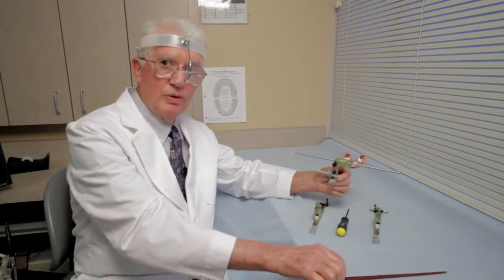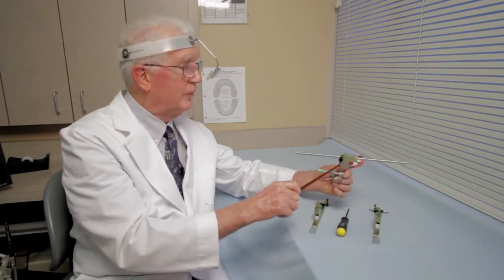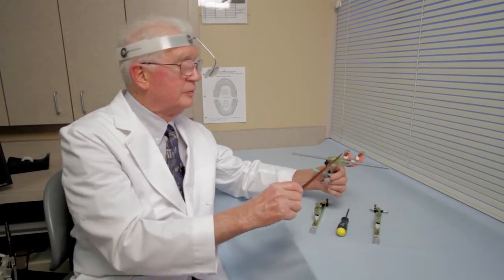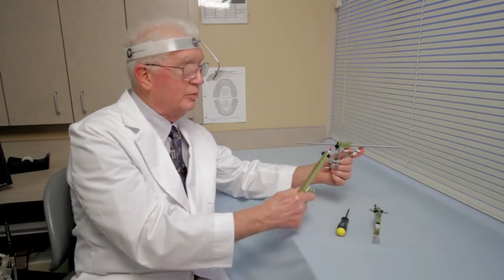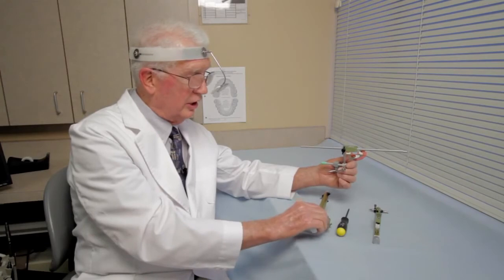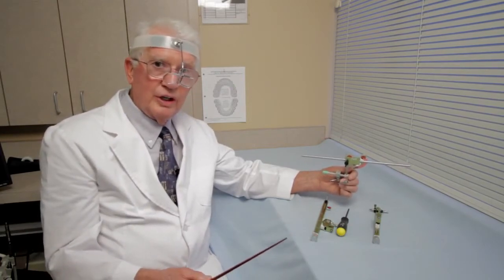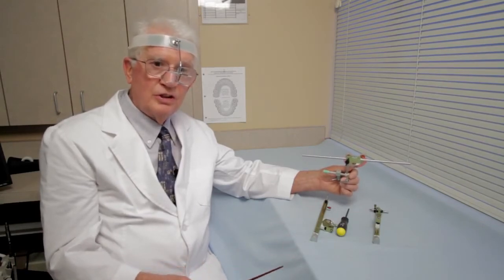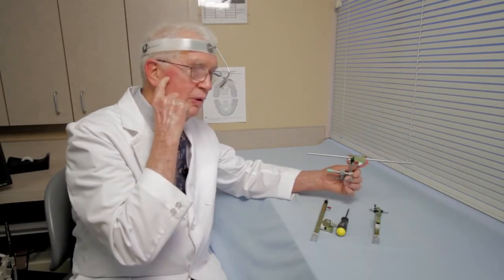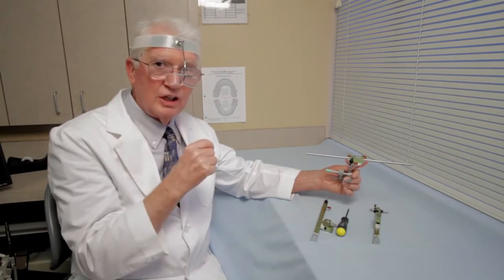And then after we did the ear bow, we took off the bite fork assembly, and I placed this crossbar on. This crossbar then is used to hold the side arms when we start to take the hinge axis facebow. Now, also, you remember that when we did the hinge axis recording, we located the hinge axis, and then we marked that hinge axis on the patient's skin. We put a mark here on each side on the patient's face that was the hinge axis point.